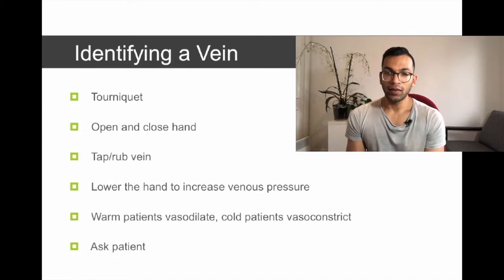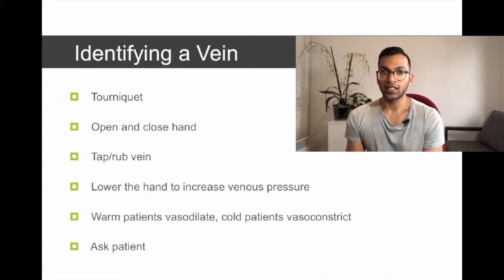When you apply a tourniquet, make sure that it's above venous pressure but below arterial pressure, so really not that tight. And you can use a blood pressure cuff if you didn't have a tourniquet to make this work for you and be really precise about what you do.